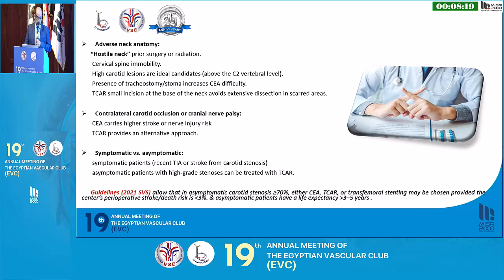In contralateral carotid occlusion or cranial nerve palsy, carotid endarterectomy has a higher stroke and nerve injury risk, contrary to TCAR, which provides an alternative approach.